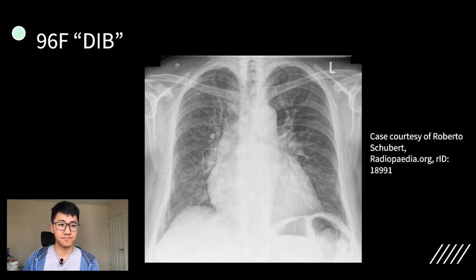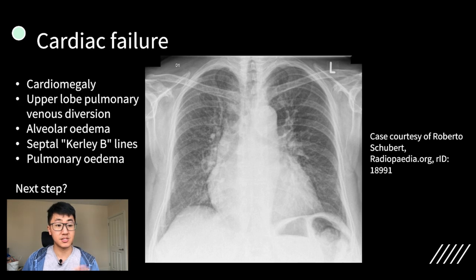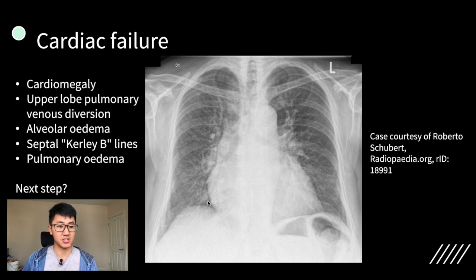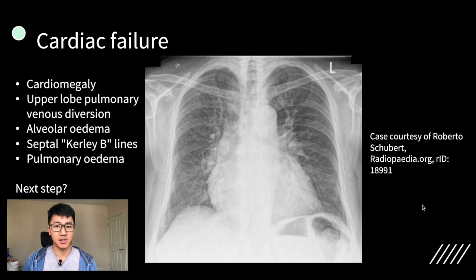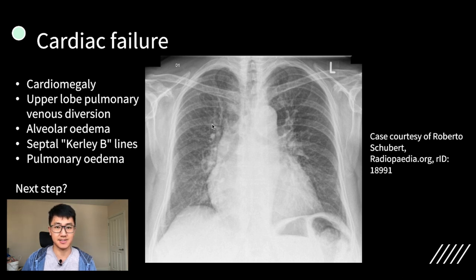Now pause the video and have a look at this one. So this chest radiograph demonstrates many of the features of cardiac failure. Firstly, you have cardiomegaly or a large heart. On a PA projection, the width of the heart should be less than half of the width of the thorax, so in this case you can see it's more. Other features include upper lobe venous diversion. This is sometimes called the stag's antler sign, where you can see the upper lobe pulmonary veins distended like stag's antlers.